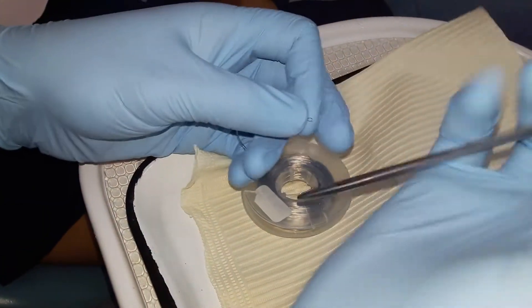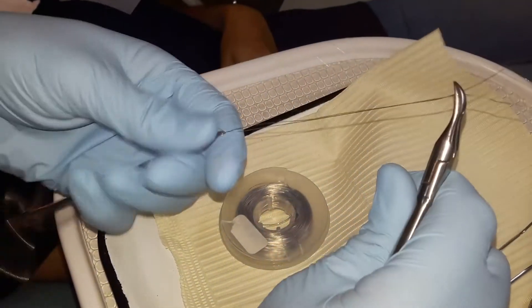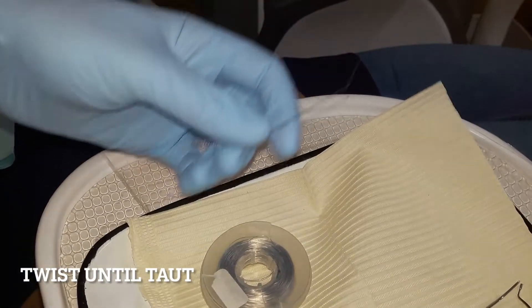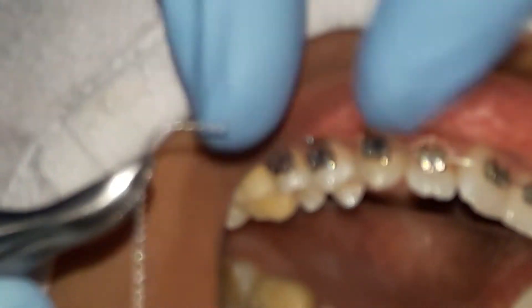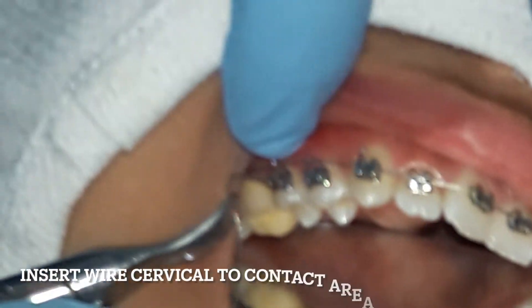I cut an 8-inch long ligature wire, joined both ends, and twisted it until it becomes taut. I then cut both ends to keep it sharp, and bent one end of the twisted wire into a hook.